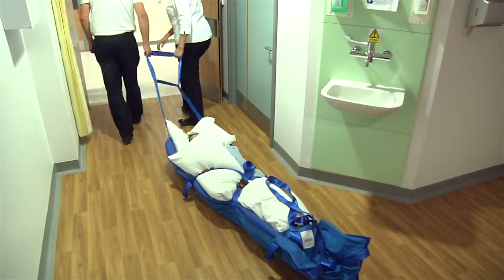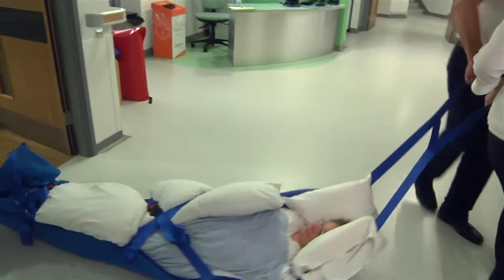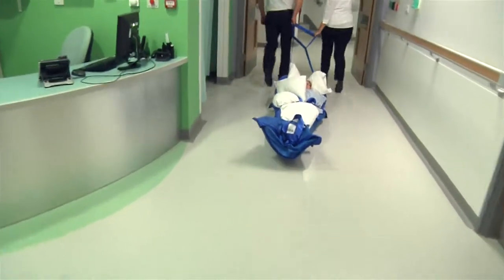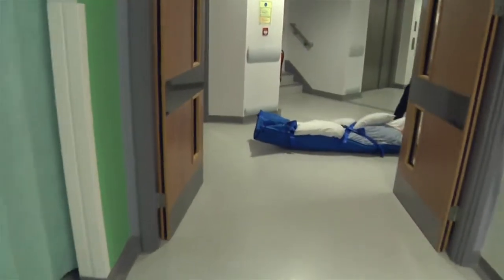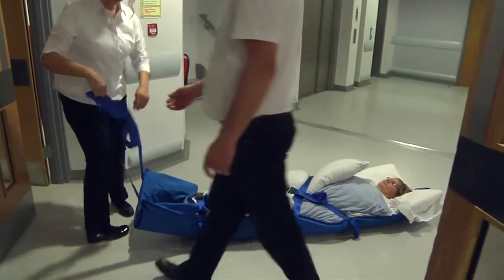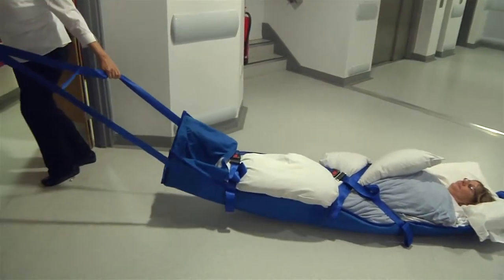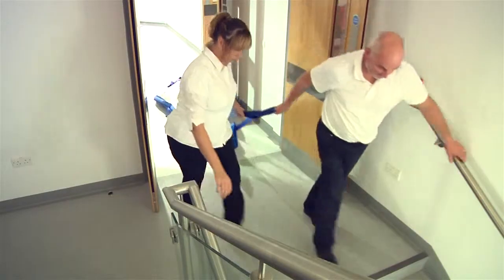Once the ski sled is on the floor, both operators should pull it from the same end. If doors are to be negotiated, the ski sled should be pulled from the head end to avoid doors closing on the patient's head. However, it is vital that the patient approaches the stairs feet first, so be careful to ensure that turning the ski sled around in a narrow corridor is not required to achieve this feet-first position.